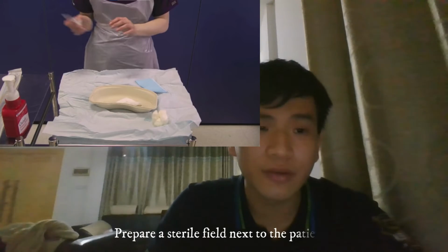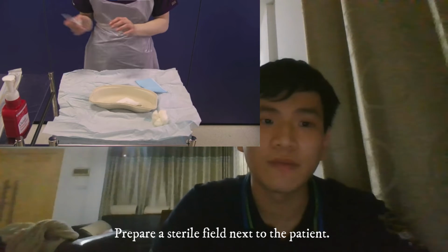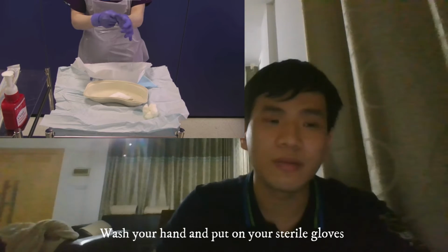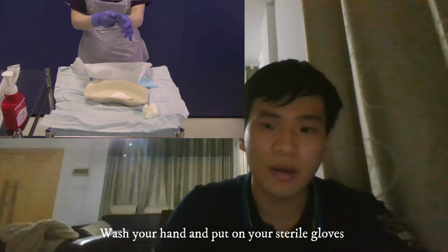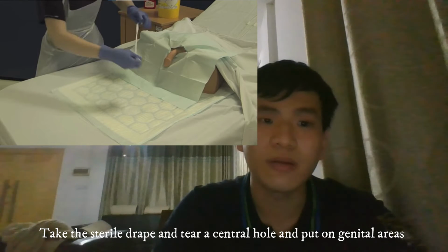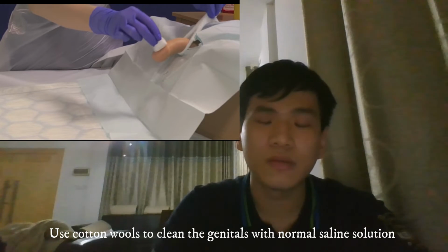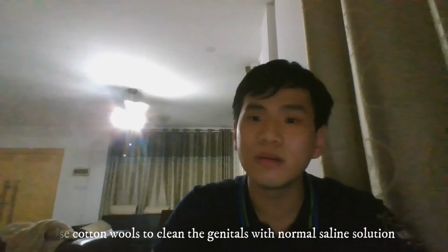Now we're going to move on to how to correctly drain urinary output through catheterization. So first of all, you need to prepare a sterile field next to the patient's bedside. You open the outer packaging of a catheter pack onto the trolley and decontaminate your hands. The procedure will be, first of all, wash your hands, then put on your sterile gloves. Take the sterile drape and tear a hole in the center, draping over the genital area of the male and female. Use at least about 5 cotton wool balls to clean the glans of the penis and the penile shaft, and for the females it will be the part of the labia.